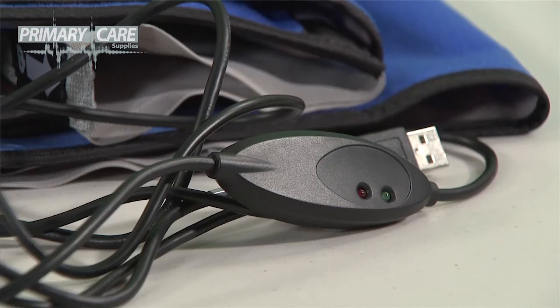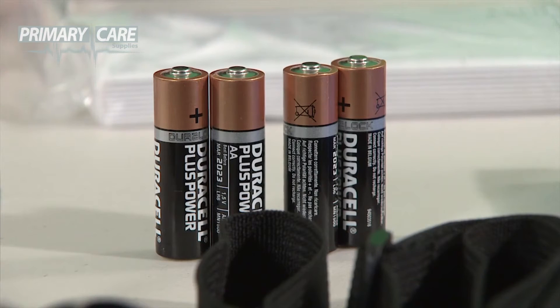Also included is a carrying case, a waist belt and shoulder strap, a USB to unit interface cable, and finally 4 AA batteries, though you can also use rechargeables.